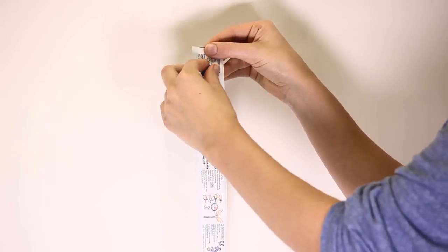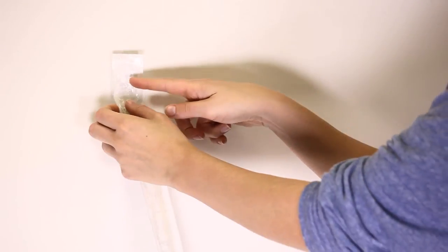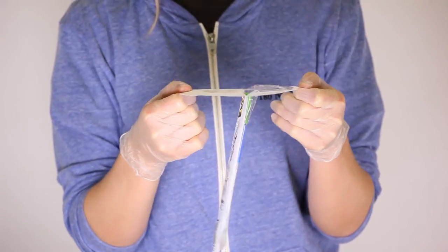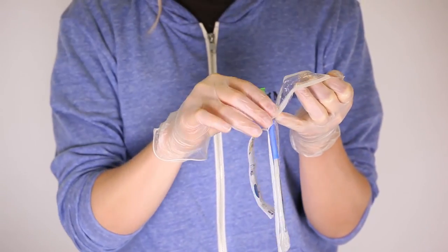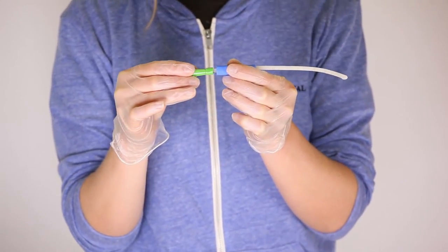You can use this blue tab on the back to stick it to a wall while you wash your hands and wait. Your hydrophilic catheter is now ready for use. To open, simply open up the packaging and remove the catheter. No more worrying about additional lubricant or painful insertion.